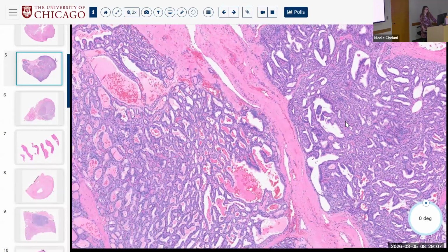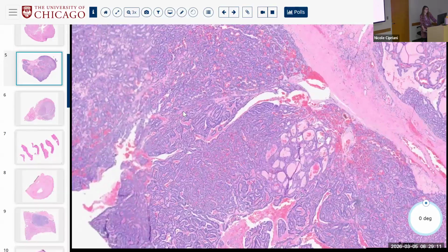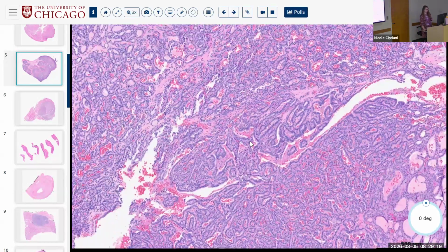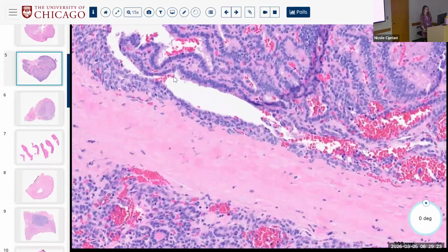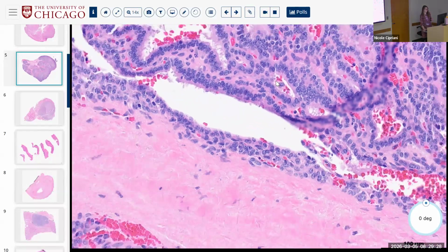Okay, so I might say with certain features in some spots. Sure. So we've got a variety of features. I heard there's some papillary growth. Yes. There's some follicular growth. Yes. There's some cells that are maybe more tall, or quote unquote columnar compared to others, right?